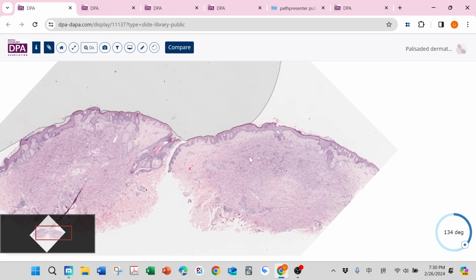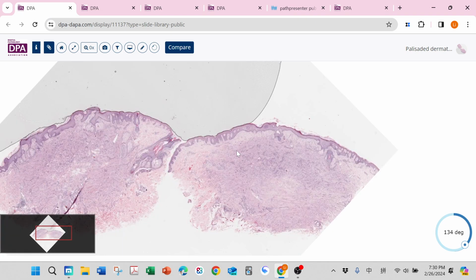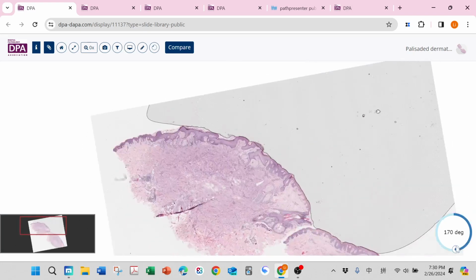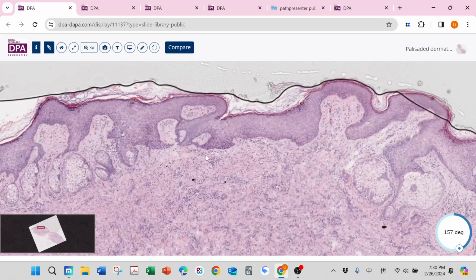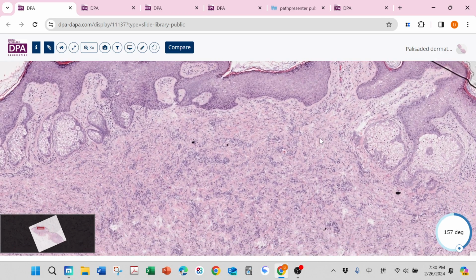This is another example of dermatofibroma, but this one I would just like to show you. We can see a lot of sebaceous glands on top of this lesion, and then some areas almost look like follicular induction. So in dermatofibroma, you can induce sebaceous gland reaction and also this follicular induction on top of the dermatofibroma.